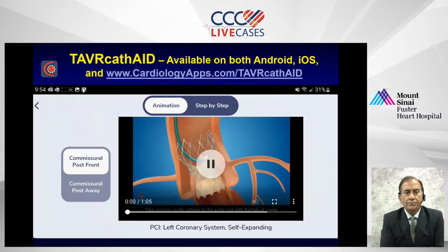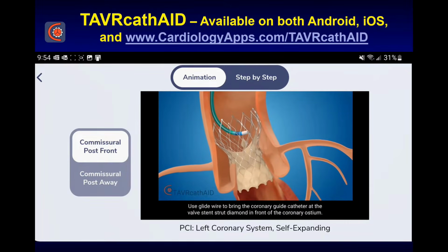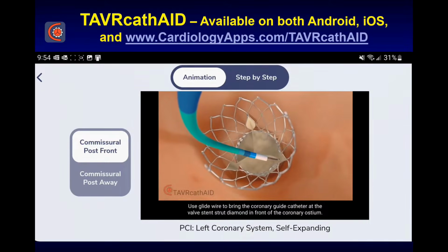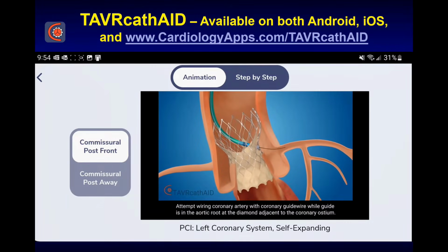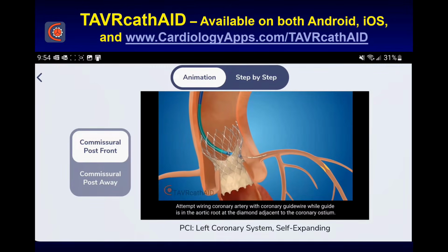Yeah. So there's no way that it can get deformed. Look at the diamonds, the way the diamonds have been created. Yes, yeah, there are four. I'm just wondering if his question relates to some role of imaging there. How will imaging show that the diamonds have been distorted? By withdrawing the guiding catheter all the way? No, the question you're saying is not needed. Not needed, you will not be able to see it.